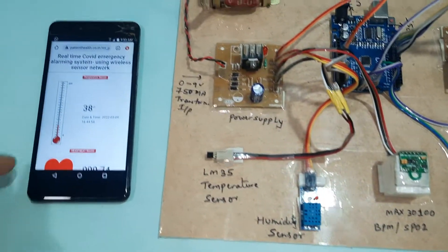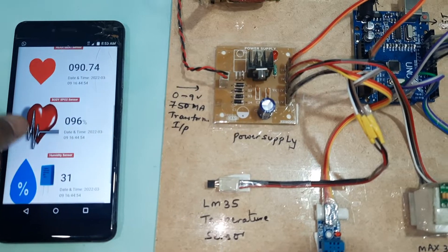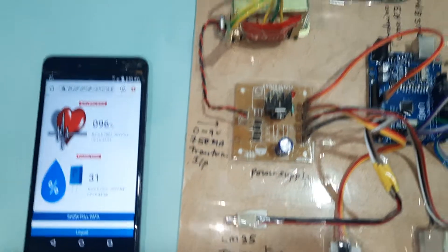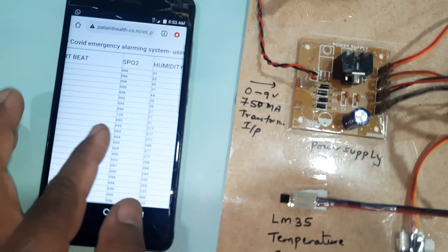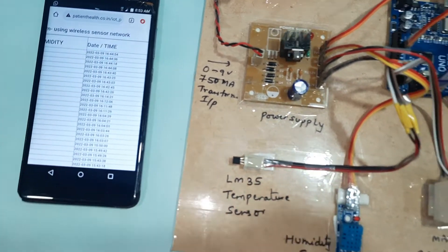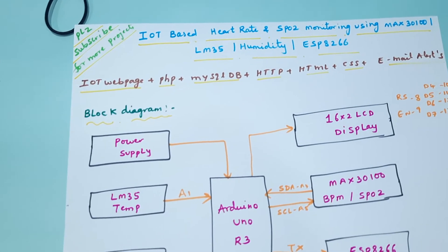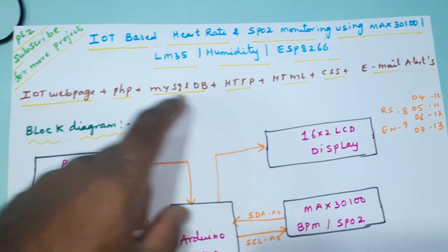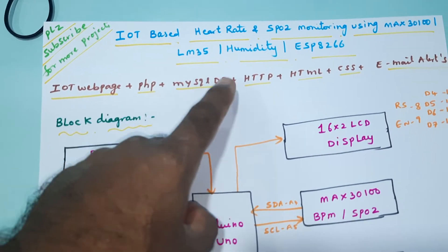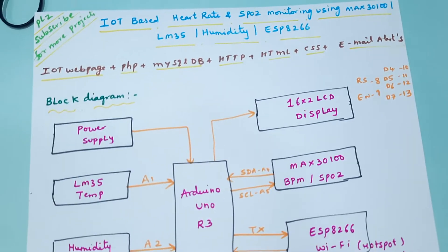Hi, we are from SVS Embedded. The project title is IoT-based heart rate and SPO2 monitoring using the MAX30100 IC. We are also using an LM35 temperature sensor, a humidity sensor, and sending the data to an ESP8266 module.